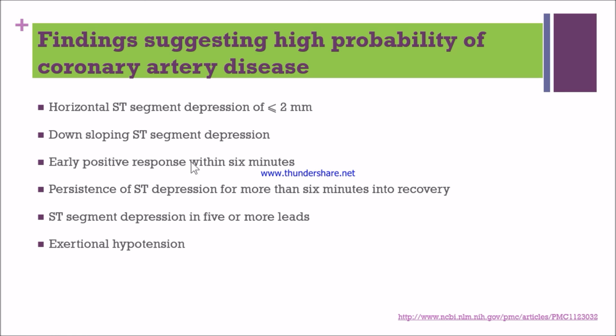to stop the exercise. If ST segment depression persists for more than 6 minutes in recovery, that suggests severe coronary artery disease, severe blockage, so we need to stop the exercise because the patient is not getting enough oxygen. So immediately stop exercise and refer to the physician. This is, as a physiotherapist, our duty. If there is ST segment depression in 5 or more limb leads, it suggests severe coronary artery disease. Exertional hypotension may lead to some kind of ST segment changes, so we need to stop exercise and refer to the physician.